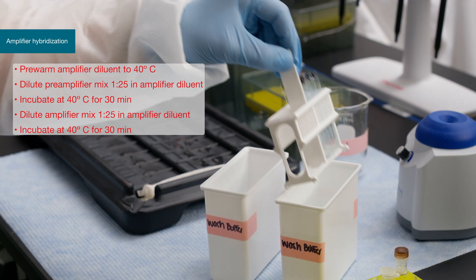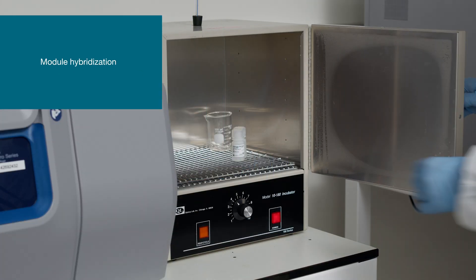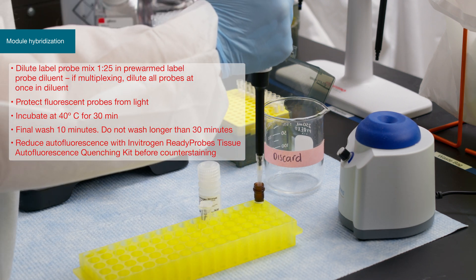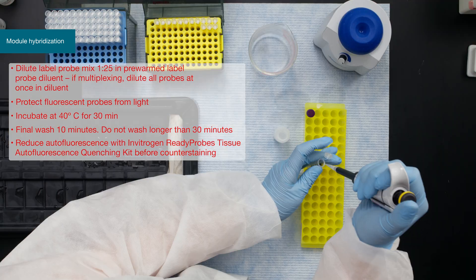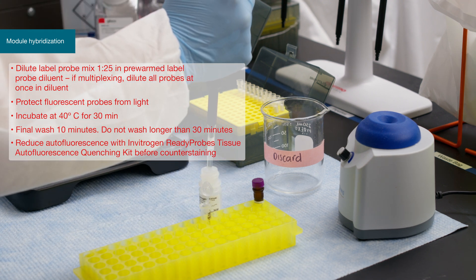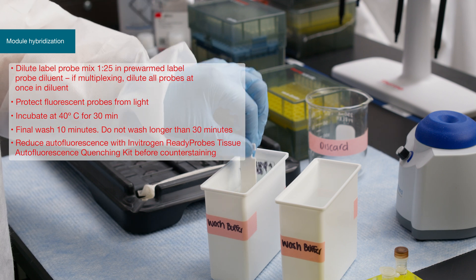Wash the slides again three times before moving to the label probe hybridization. After the amplifier hybridization, proceed to module-specific hybridization. If multiplexing, label probe hybridizations can be done simultaneously. Dilute the label probes in the pre-warmed label probe diluent, flood the tissue samples with 400 microliters, and incubate for 30 minutes. After incubation, wash the slides three times in wash buffer, with the last wash being 10 minutes.